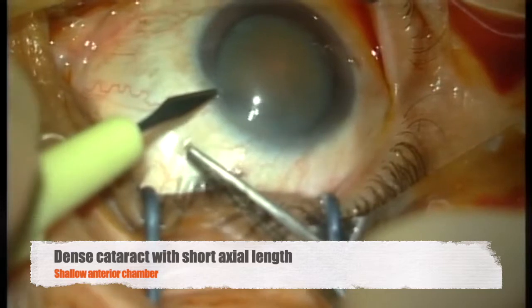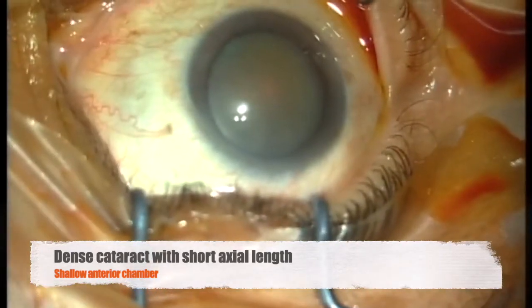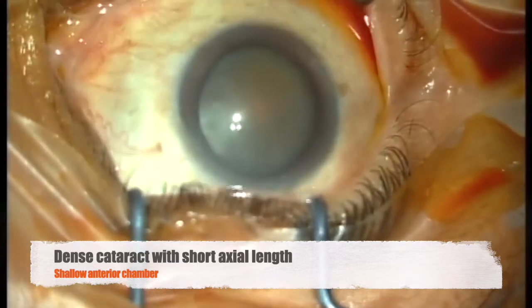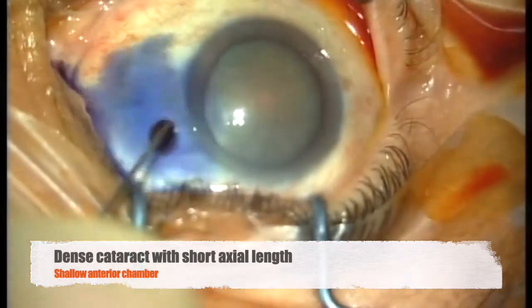Hi. This is a sharing on one of the techniques for dealing with hard cataract in a short eyeball. The surgeon uses the stop and chop technique. This is a 69-year-old patient who presented with counting finger vision.